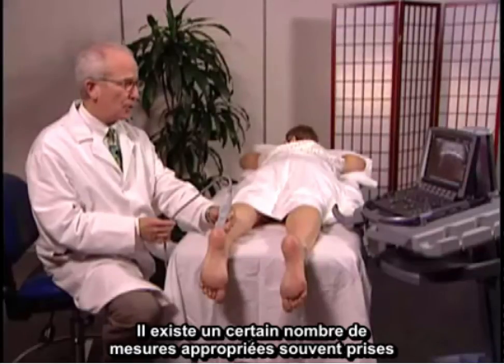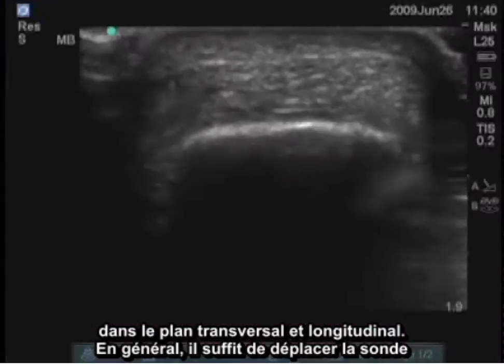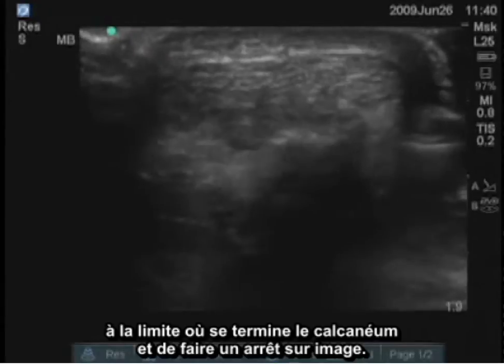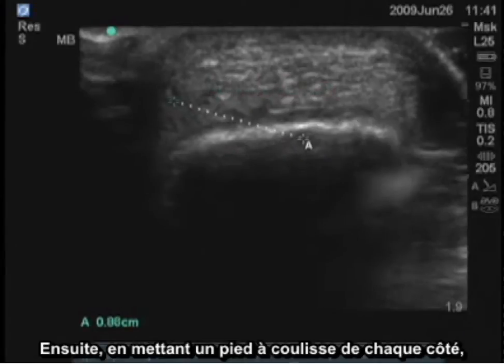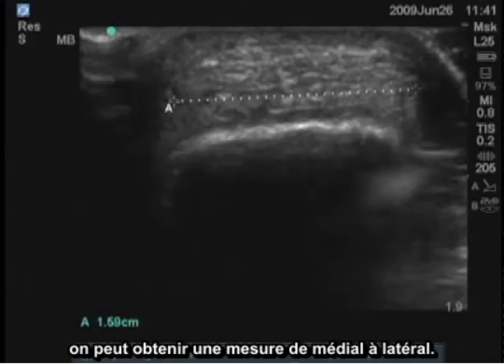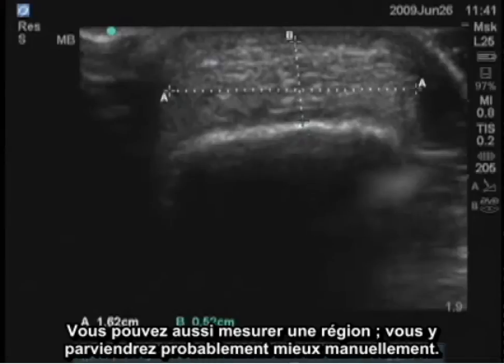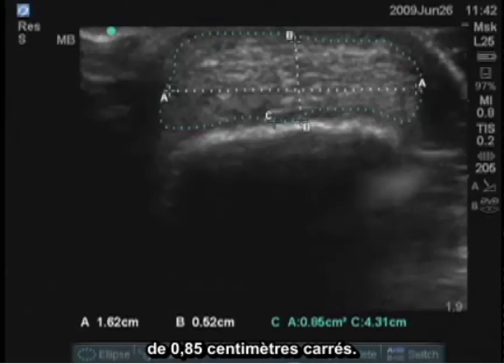There are a number of appropriate measurements frequently taken for assessing the size of the Achilles tendon. These can be done both in the transverse and longitudinal plane. Usually we go just to the border where the calcaneus ends and freeze the image. Then using the calipers, you place one on each side for a measurement from medial to lateral, and then get another measurement of thickness from superficial to deep. You can also measure an area — probably the best way to do it is manual — and this gives us an area of the tendon in cross section, which in this case is 0.85 centimeters squared.